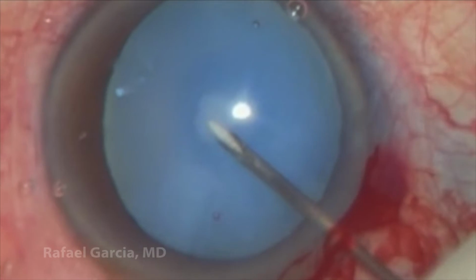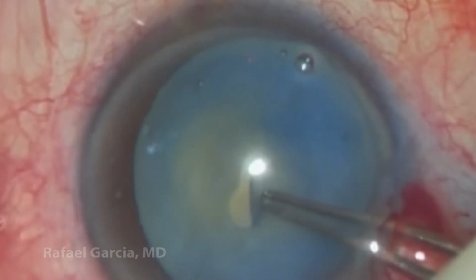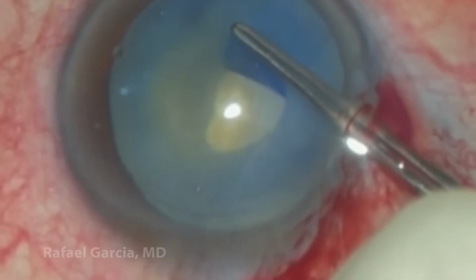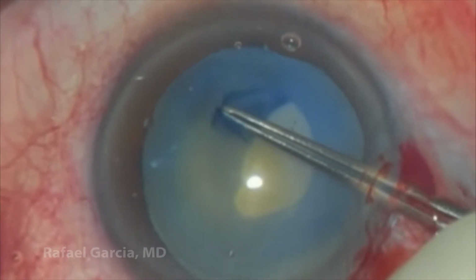A key point in this surgery is to decompress the capsular bag. So before the beginning of the capsulorhexis, a 27 gauge needle is used to poke the anterior capsule and aspirate this fluid-filled cataract. This is a nice move to avoid the so-called Argentinian flag sign, which is a sudden rupture of the anterior capsule.